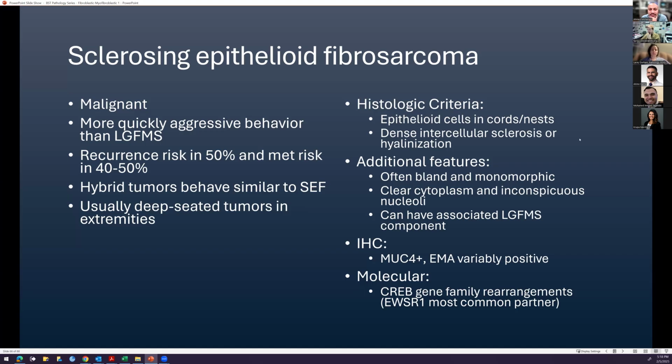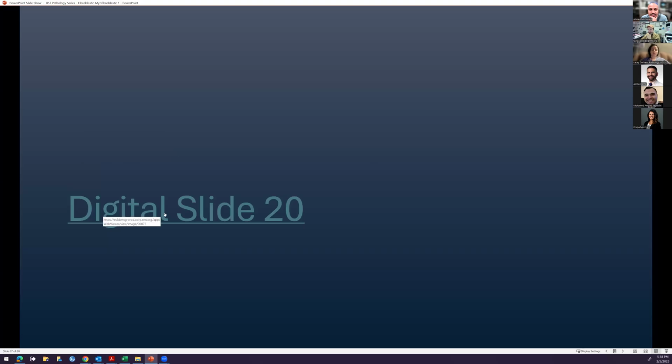All right. Let me see. So next up, I think I have another slide. Let's take a look. All right. Oh, that's right. First of all, give me 1 second. This one I actually wanted to show on glass. Let me pull open my cellSens real quick.